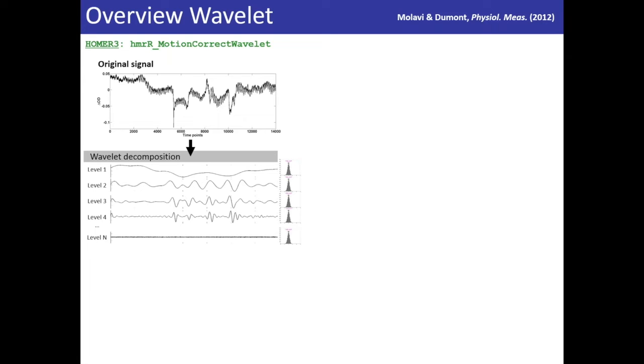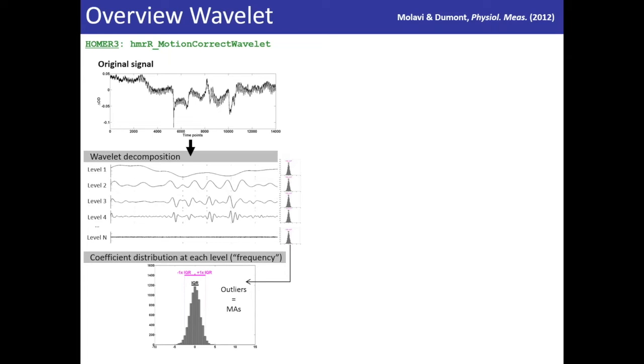Here, one would first decompose the signal into its wavelet components. Now we are in a frequency time domain. The assumption is that when you have these wavelets, the wavelet coefficients will have a normal distribution, and the outliers will be due to motion artifacts.